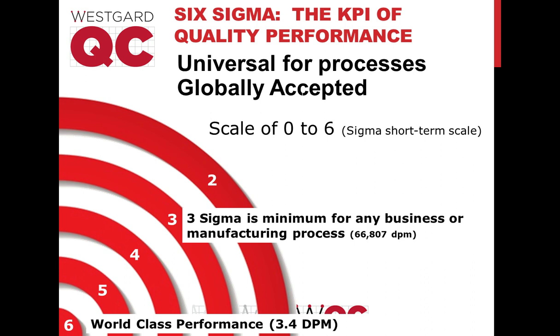And that does mean there's a challenge about what rules you're going to apply, how many controls you're going to run, and even now that we have the QC frequency guidance, how often you're going to run QC. And of course, it's impossible to change the frequency of QC on an index. You can't be running once per 1,000 on your hemoglobin, but then on your MCV, running once per 500. You can't vary the number of controls that way. So effectively, you have to come up with a compromise that covers all of the different parameters.